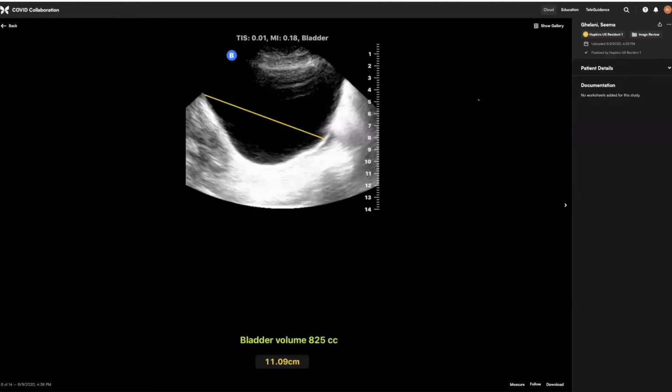So the echoes returning from the deep surface of that fluid-filled structure are going to be stronger than the surrounding echoes. So when you're imaging something like the gallbladder or a distended bladder, you may want to decrease the gain selectively in the far field of the image, or you may want to decrease the overall gain, just to make sure you don't wash out the posterior aspect of the bladder here. Because if you look deep to the bladder, it's so bright white, it's so overgained down there that you might miss some detail like free fluid or something else that's lurking behind the bladder.